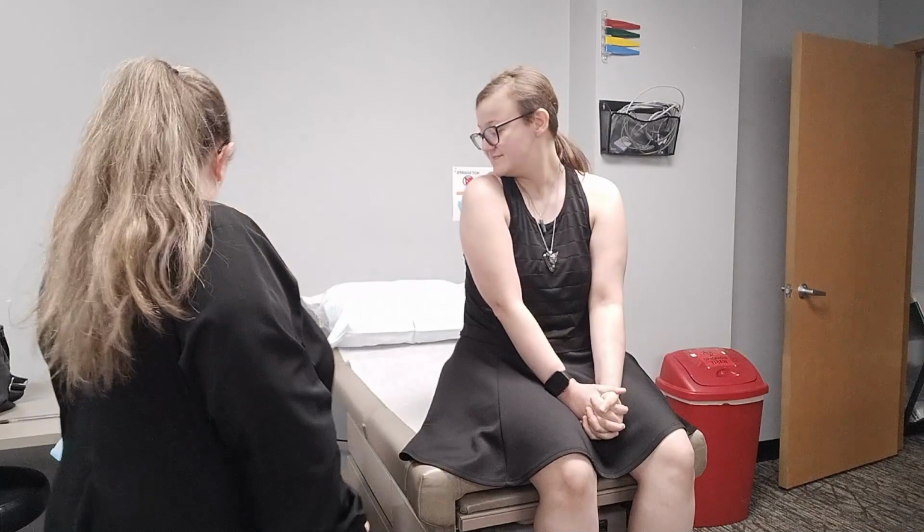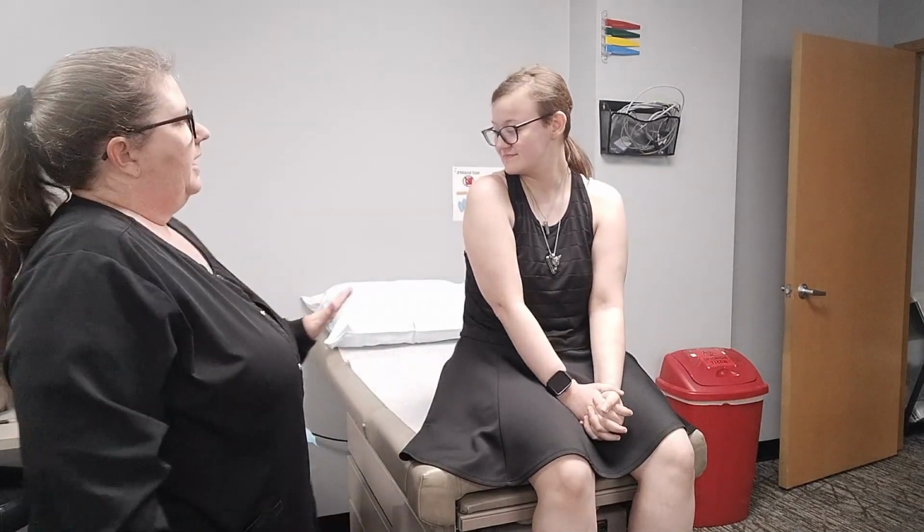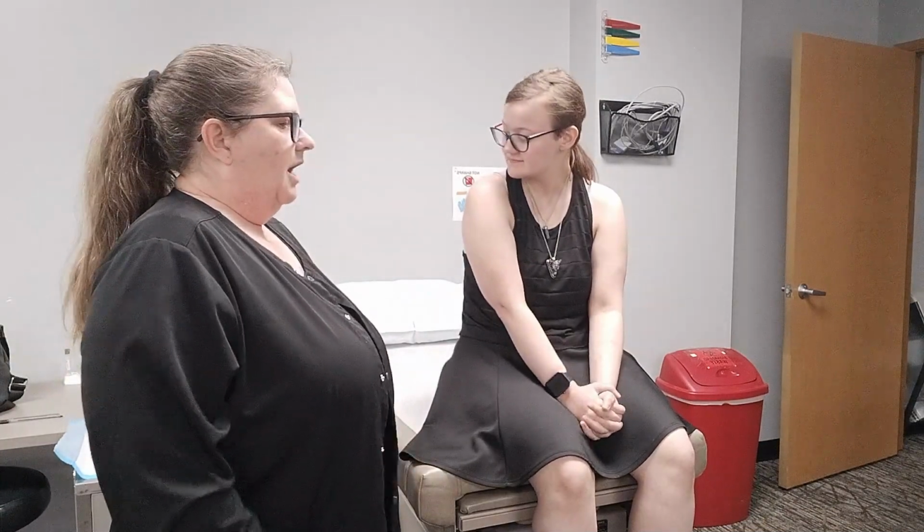I have not. Okay, so what we're going to do basically is take a swab and collect a specimen from your tonsils. And then we're going to test it right here. We should have results immediately. It can feel a little weird. It can almost make you gag sometimes. So just try not to do that, but everybody gags a little bit sometimes.